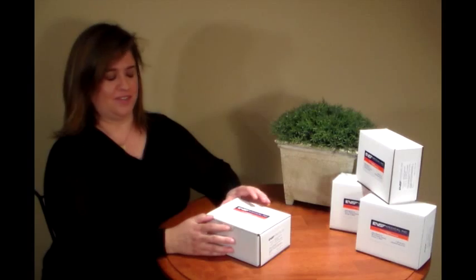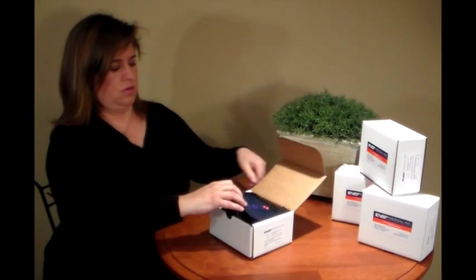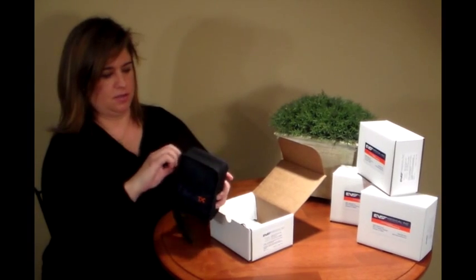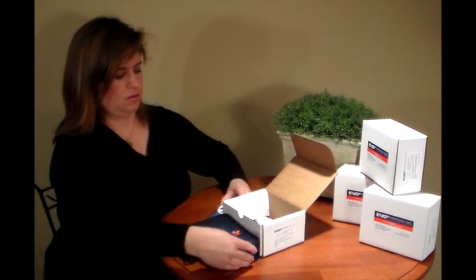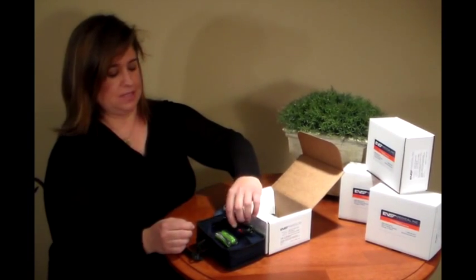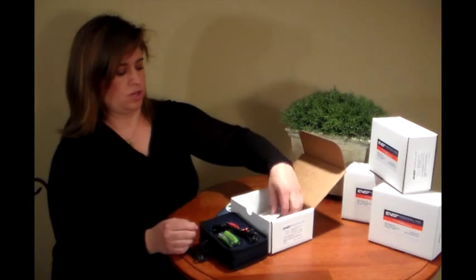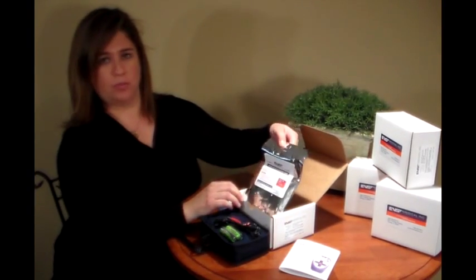When you receive your First TX device, your box should include your device and carrying case, a set of batteries, electrode leads, your instructional manuals, and a set of electrode pads.